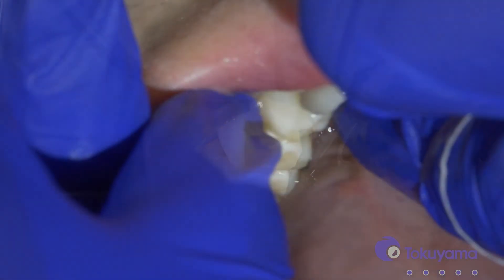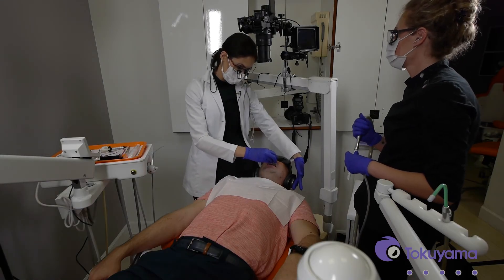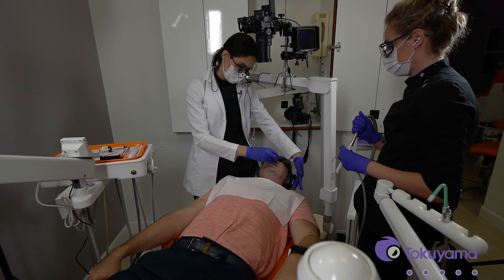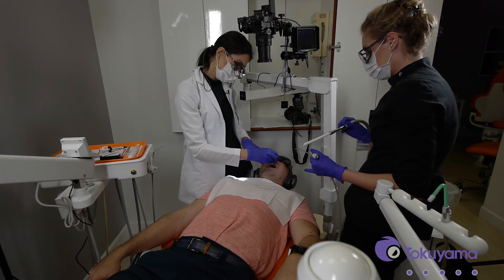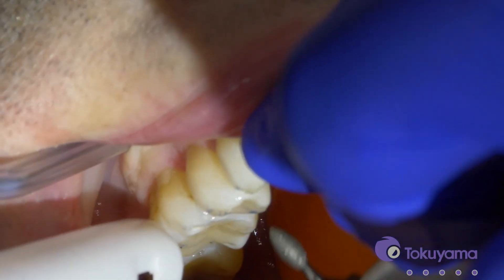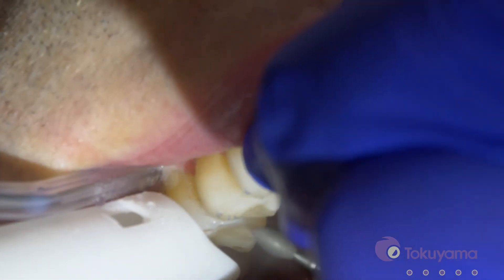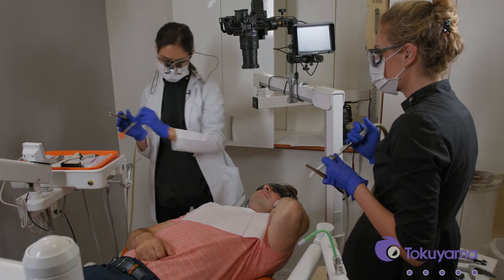Let's take the rubber dam off and we'll check the bite. Bite closed and chew. We do have a little bit of a high spot, so let's adjust that. I like to use a polishing diamond like that and then we'll get that high spot off. We'll check the bite again and chew. Do a little bit of polishing.